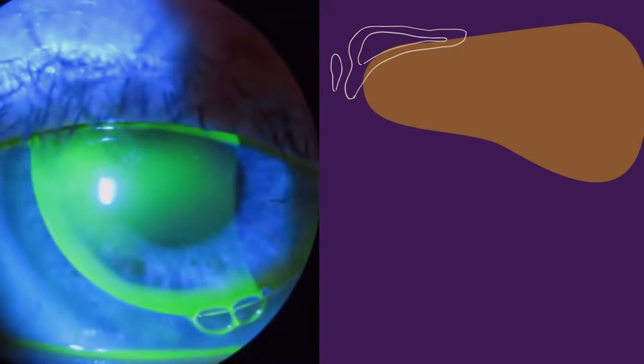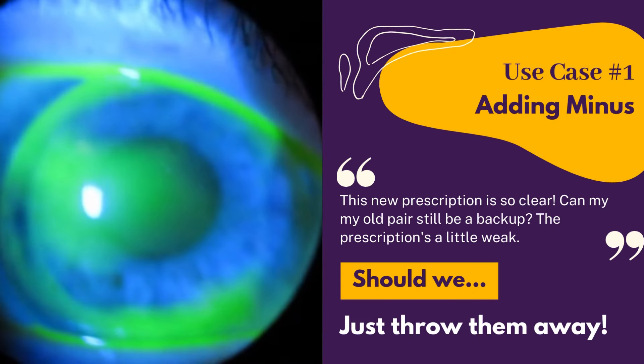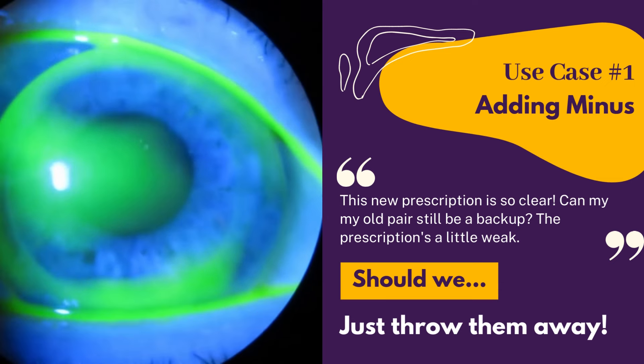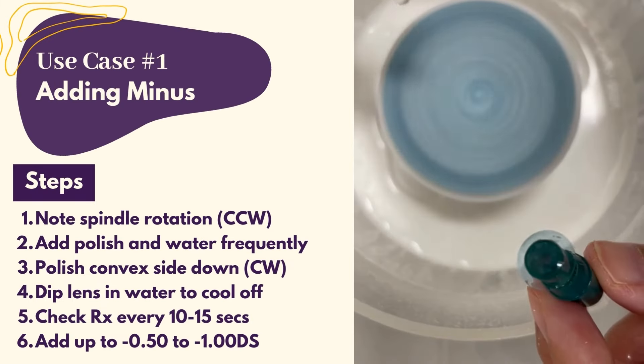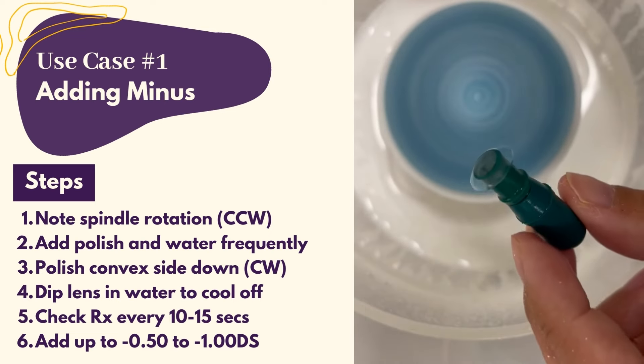Modifications can be quick and simple for the right cases. Case number one is simply adding minus to a patient's old lenses so that they can use them as a backup without throwing them away. Most spindles rotate counter-clockwise, so you should turn your greenie clockwise as you modify. Add polish and water liberally and frequently.